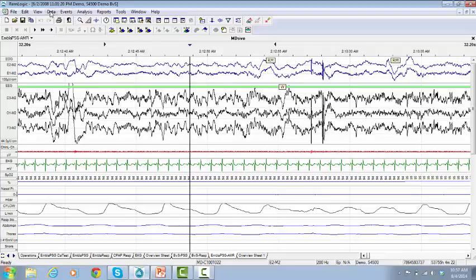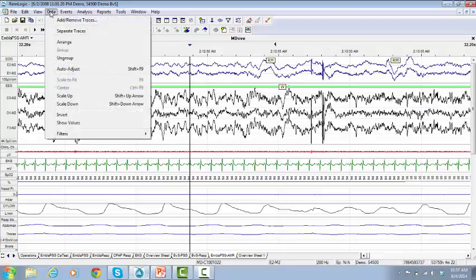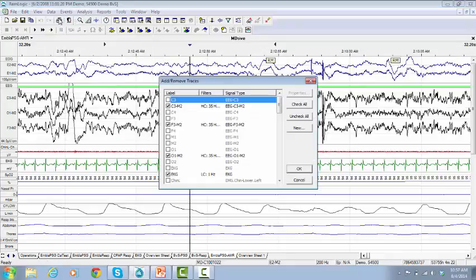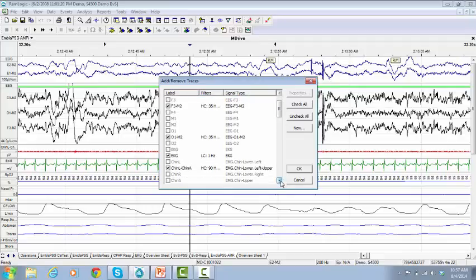Go to Data and select Add-Remove Traces. The Traces window will pop up. Drop down the list to choose your preferred traces by checking the corresponding boxes.